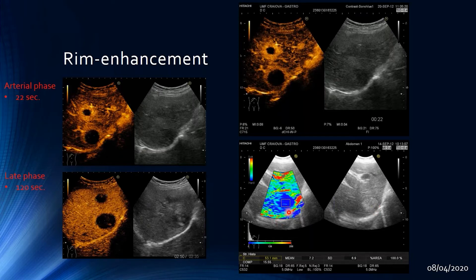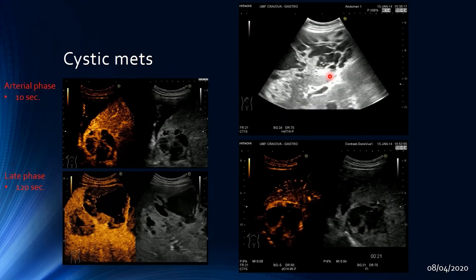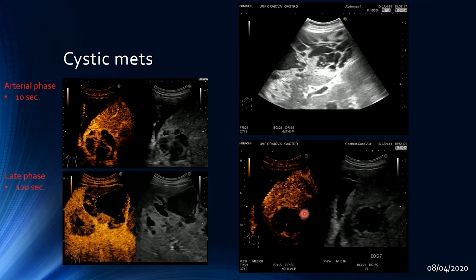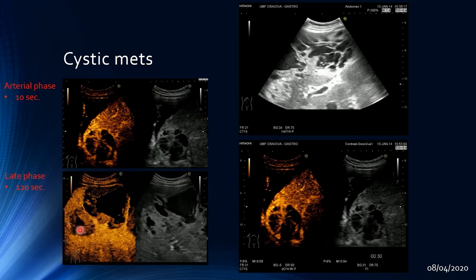Some metastatic lesions can be cystic, especially after chemotherapy. An example shows a complex lesion where the cystic walls and septations are hyper-enhanced in the arterial phase, and then the thick walls wash out in the late phase — appearing hypo-enhanced compared to the liver parenchyma after two minutes. These were cystic metastatic lesions from a neuroendocrine tumor following chemotherapy treatment.